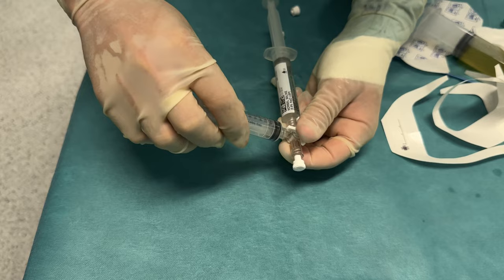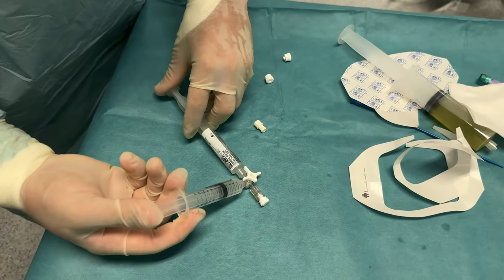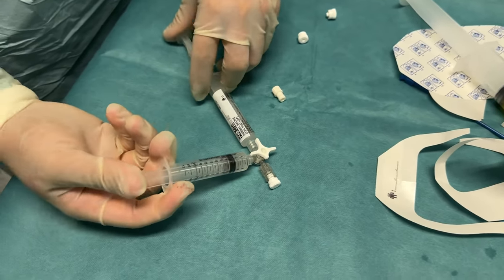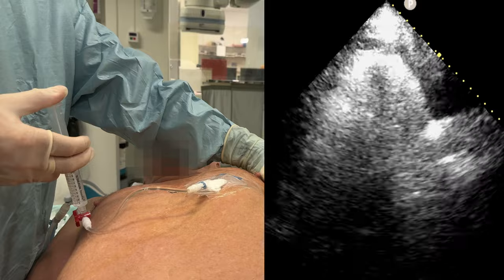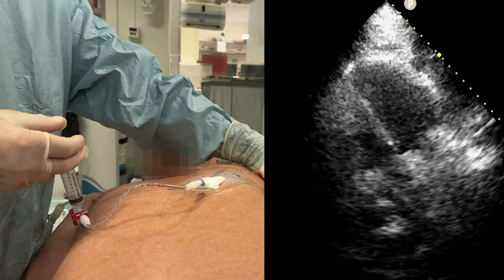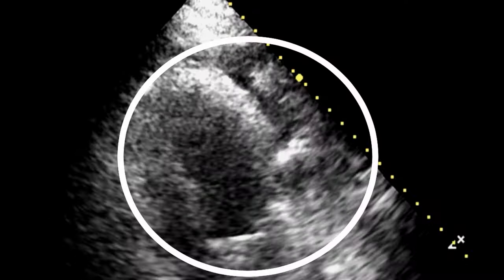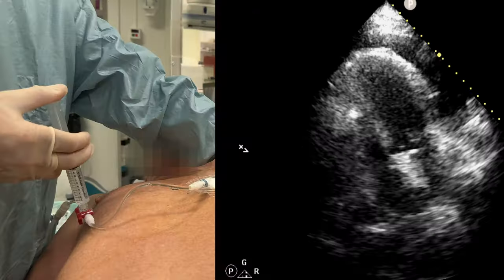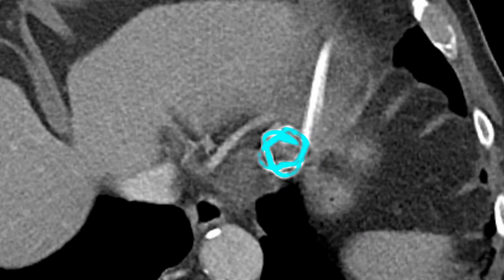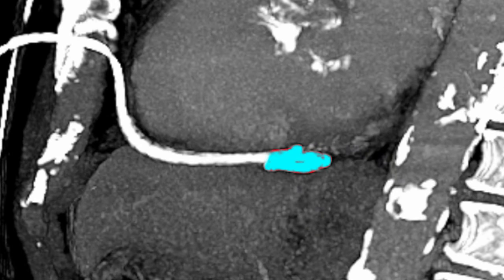Agitated saline may be used to determine the exact tip location. Use a three-way valve and two luer-lock syringes to create micro-bubbles. Inject the agitated saline while observing where the bubbles first appear. In this case, the drain tip seems to be placed outside the left ventricle at the level of the mitral valve. This is confirmed on a CT scan done post-procedure for another indication. We usually don't do a CT scan to control tip location. Note the perfect location: far caudal and dorsal, and the fluid is gone.